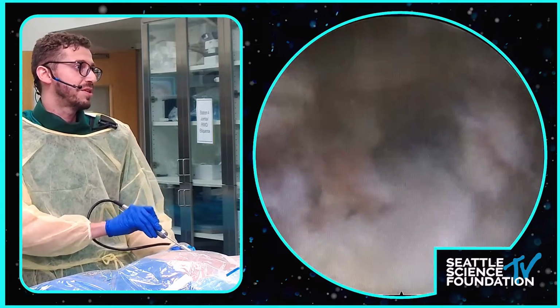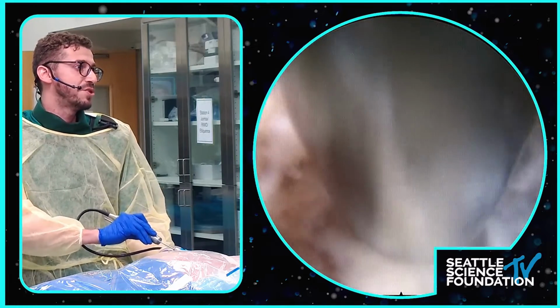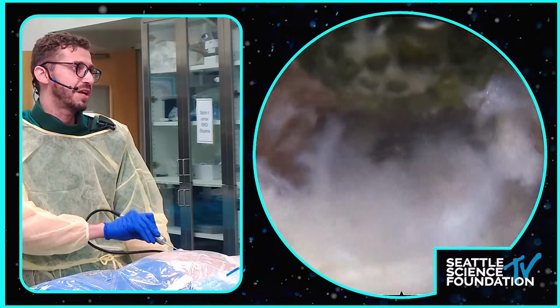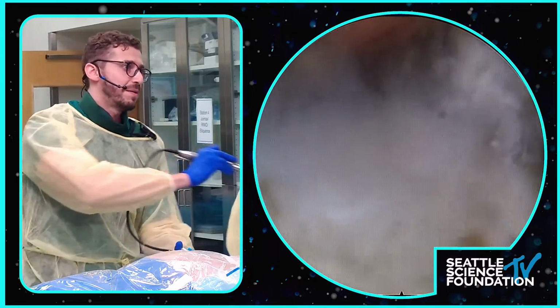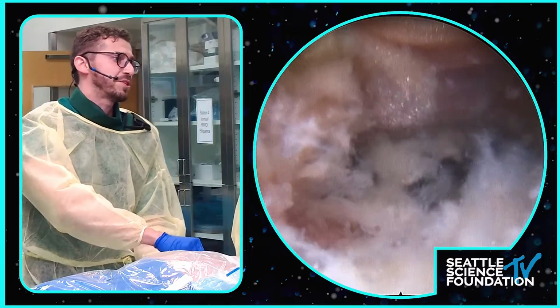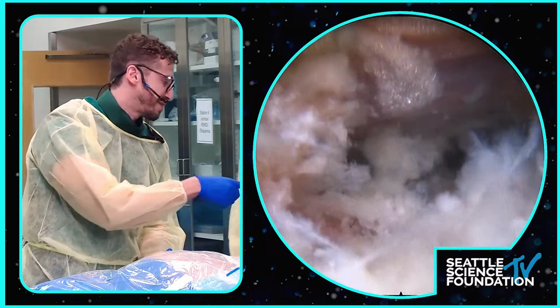If you don't see the pebbles, then it's not really working. And then the drill also has an articulating tip. So this tip is straight, but there is an articulating one. If you want to go more medial, then there is an articulating tip, especially for more central disc. Can I have the drill again, please?